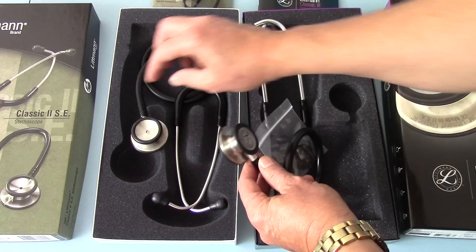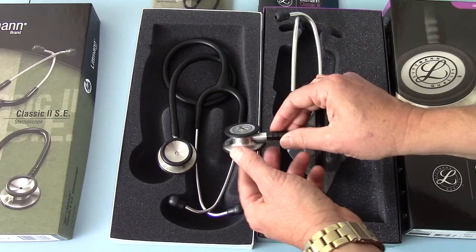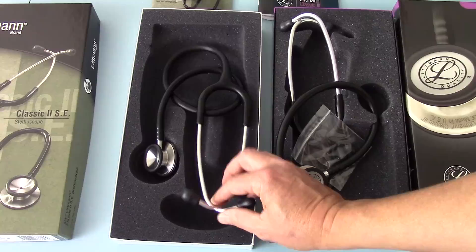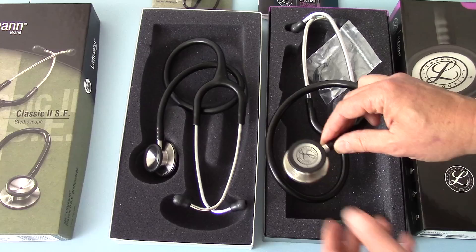The chest pieces are very similar in size and design. The depth of the Classic III appears slightly wider but there's probably only a couple of millimetres in it. The tube diameter and lumen are almost identical, and the tube length again is almost identical. The headsets in terms of springing and weight also show very little difference — the main difference is really the setup on the newly designed chest piece.